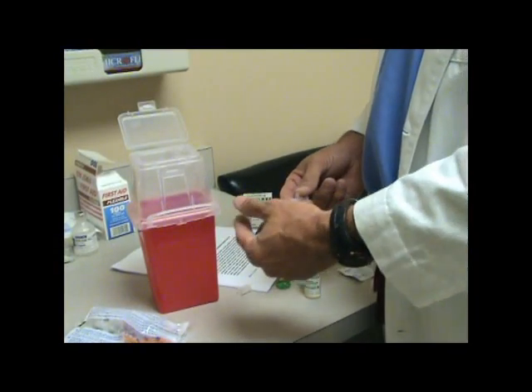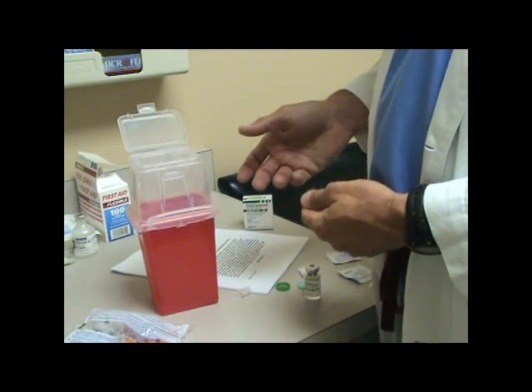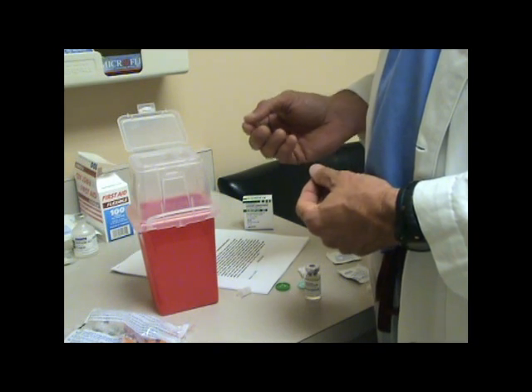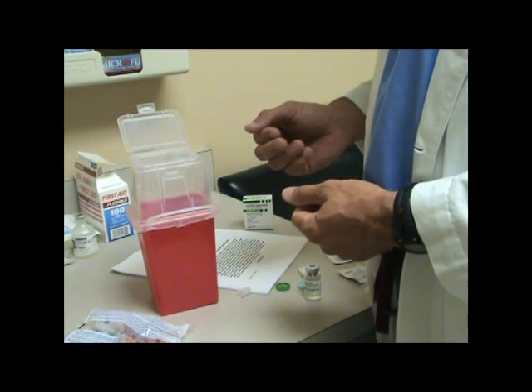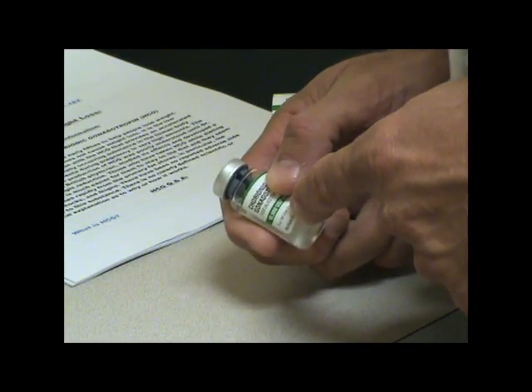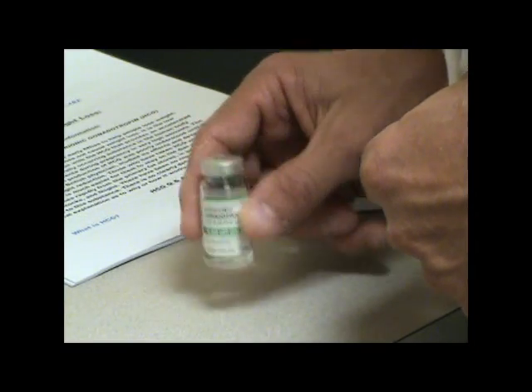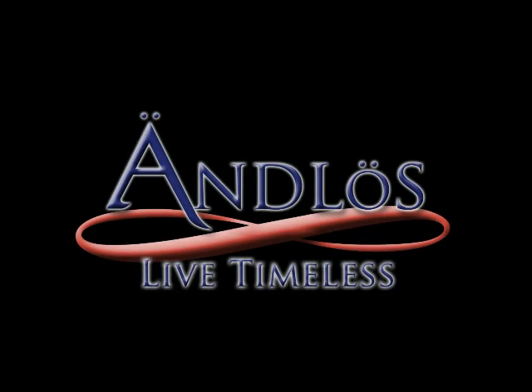When you're done, you do not have to put the cap back on. You could just throw the cap and the needle directly in a sharps container. Other people will use a milk carton or milk jug — that would be fine too. Store all those, and you can either bring them back or bring them to your local health department. Whenever you're finished injecting, place this back in the refrigerator — not in the freezer, often with the butter and cheese area so that it's not frozen. Then you can use it the next time around. That's best to do since this process goes about 42 days.